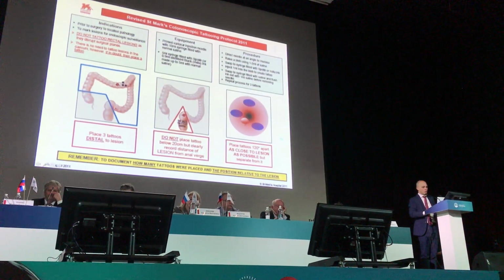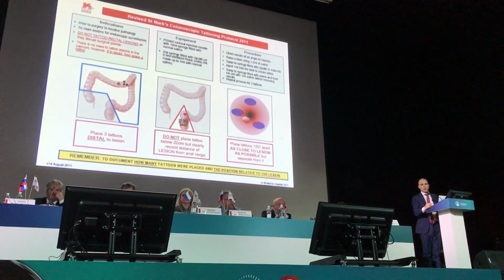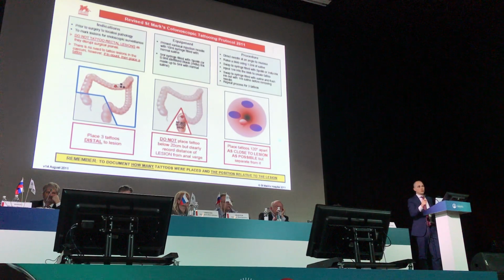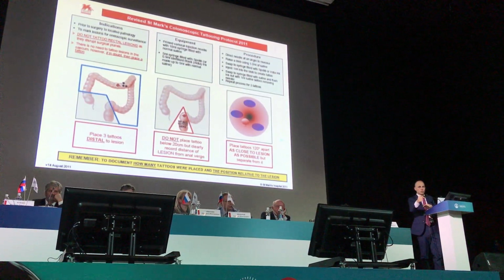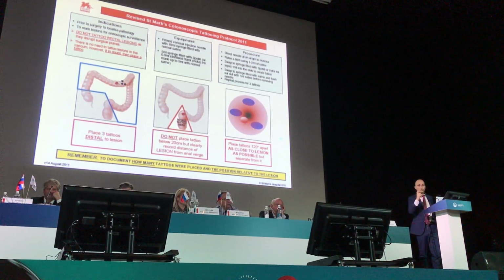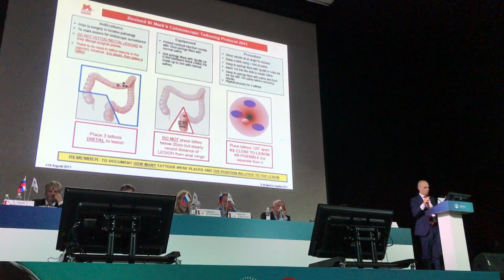Why not in the rectum? Because the rectum is the first 12 centimeters of the colon, so it's quite clear and obvious where the lesion is. What I suggest you to do is to take a measurement. The measurement should be from the lesion to the anal verge, so that you tell your surgeon exactly what the distance is, and this might change the surgical approach completely.